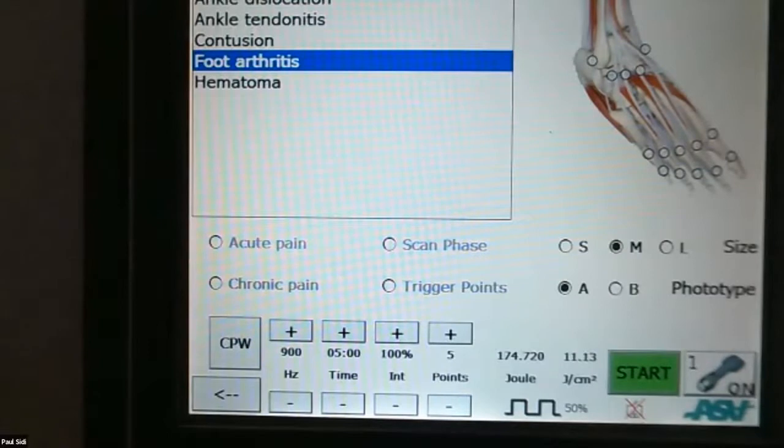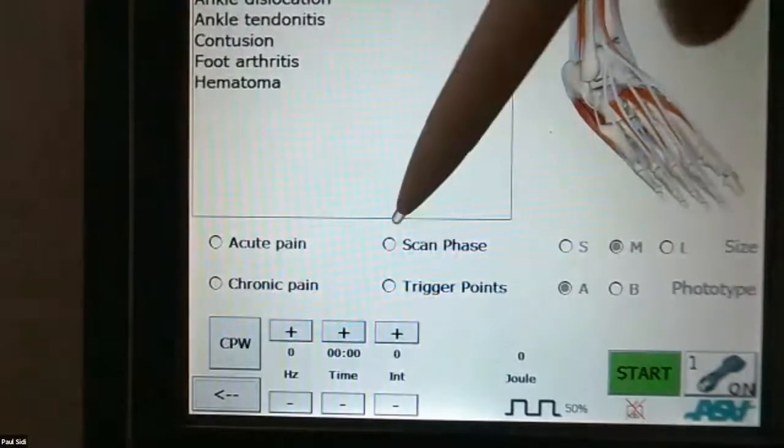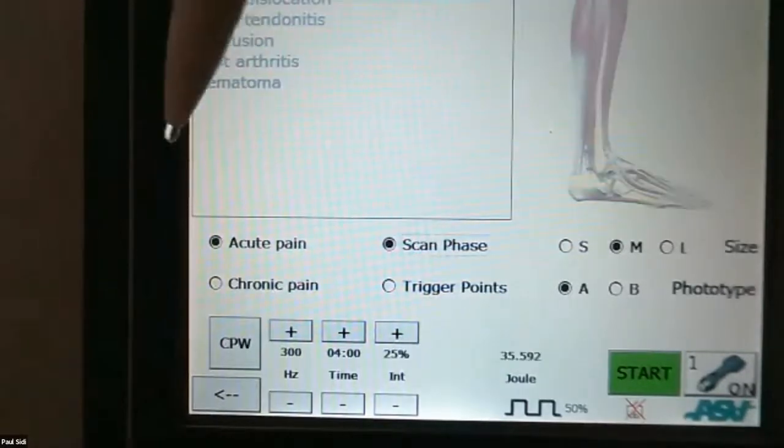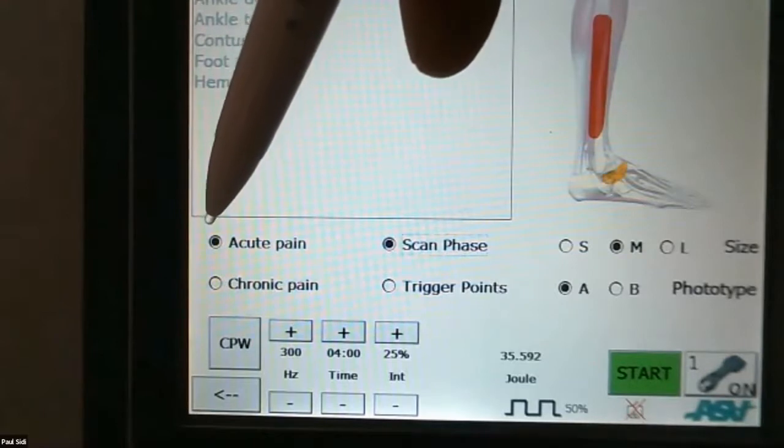Right, very quickly, I told you I'd broken all my rules. The one thing we always do, let's keep it on here, I'm trying to keep today shorter. We always do the global approach first. I would always scan this first. So I just press scan, I'm not going to do it. I'm going to scan. It's this sesamoiditis. It's not really, it's been going a long time.